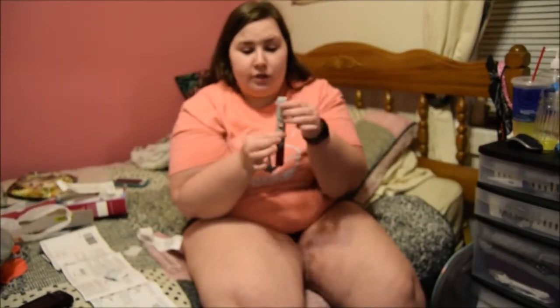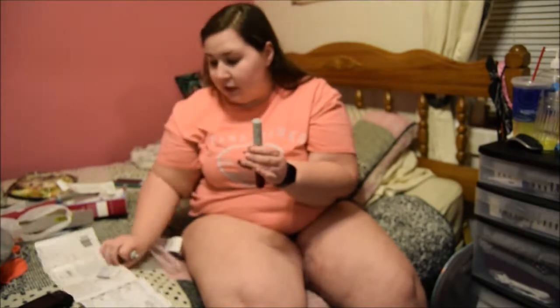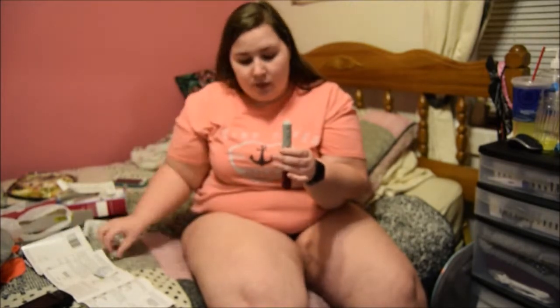I'm going to turn it upside down. This is the side with the needle on it, which is the gray side. I'm going to pop this open straight up. Do not twist these. It'll tell you in the instructions. Straight up. I'm going to set that there. And you do not put this back on until after the injection because it could mess up the needle. So I'm going to lay this on the side.